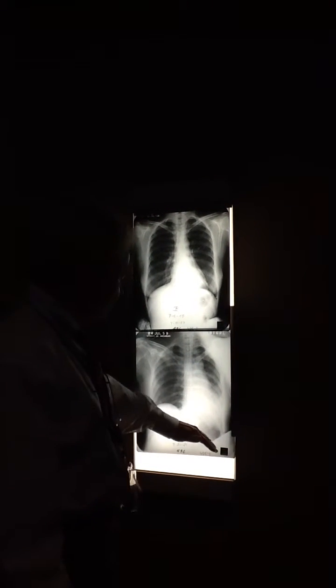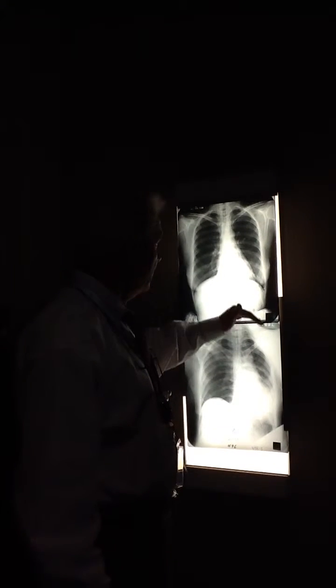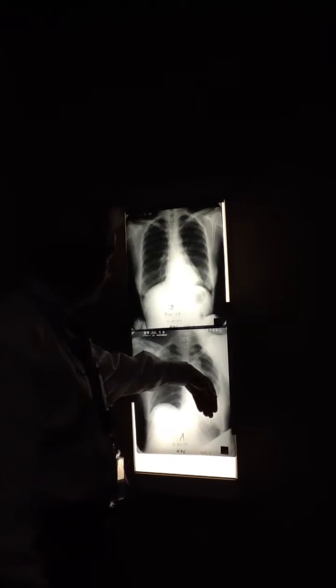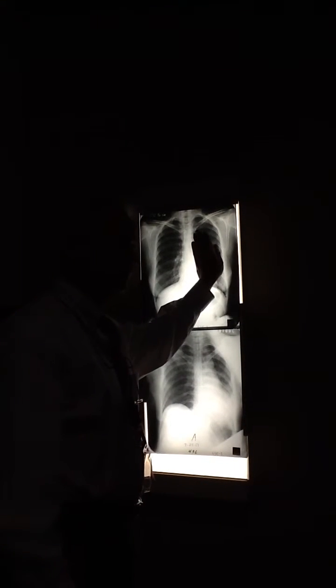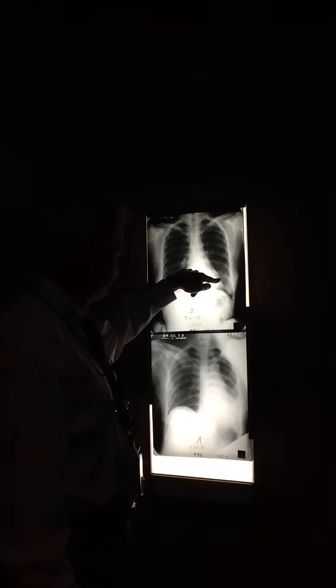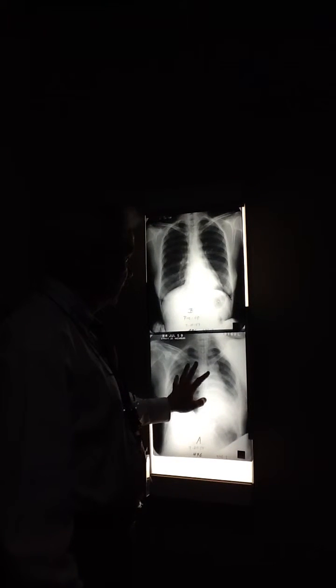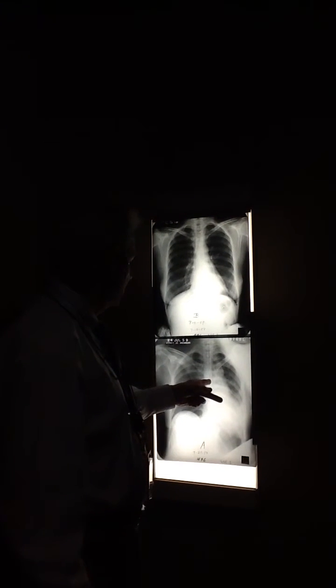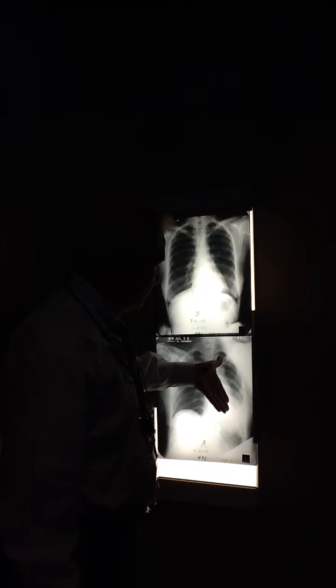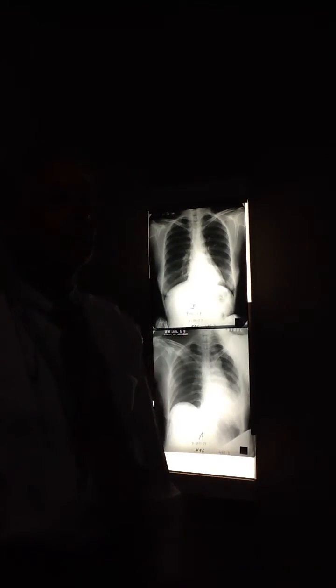And you can see the diaphragm's already coming up. Somewhere it's up in here. The heart's moving over, see it? So this came up, this is moving because we're losing volume. Okay? Not a big change in the rib interspaces. Trachea shifted very, very slightly. So the whole thing's starting to move and everything's going toward the involved side.